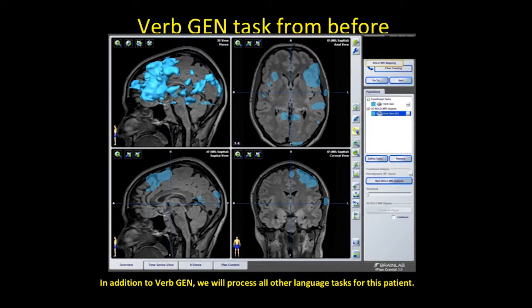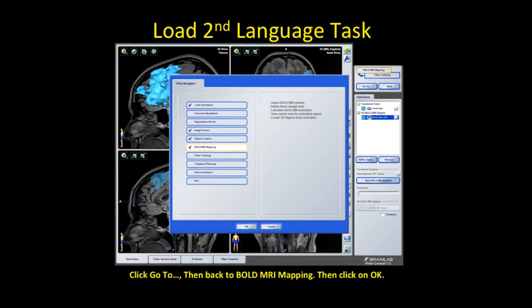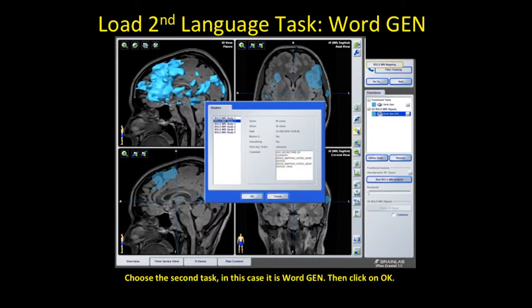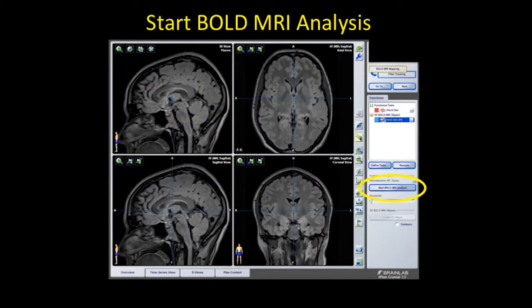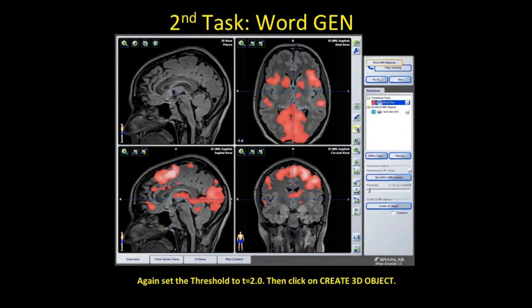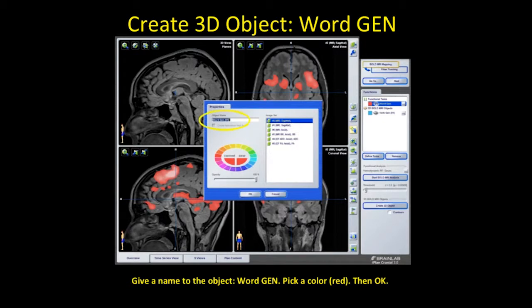Here's our verb generation task from before. In addition to verb generation, we'll process other language tasks for this patient. Click go to, then back to bold MRI mapping, click OK, and load our second language task — in this case word generation. Choose that task and hit OK. Define the parameters keeping them the same: starting at 4 seconds, blocks of 20 seconds on and 20 seconds off. Choose a different color — before it was blue, so now we'll choose red — then hit OK. Start bold analysis again. Here's our second task, word generation. Set the threshold to a liberal T value of 2.0, click create 3D object, name it word generation, pick red, and hit OK.